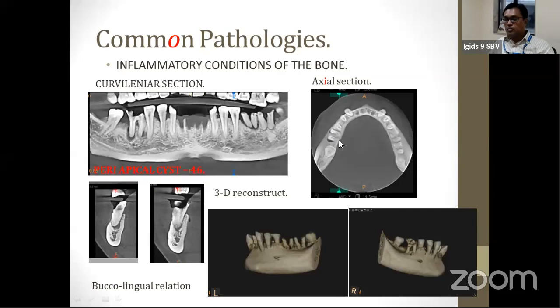So this is going to be of paramount importance to the endodontist. The endodontic point of view, yes, the lesion appearance. So now I can go further down till the root tip and find out the extent of the lesion from the tip of the root to the tip of the lesion itself. So my measurements are possible even in those directions. So this is with the axial section. There's a periapical pathology very clearly evident, and the axial section reveals it.